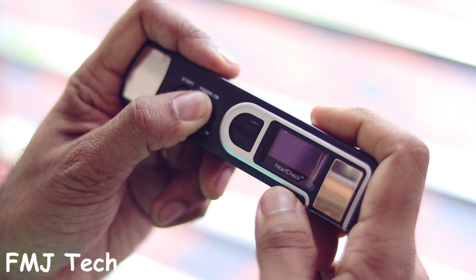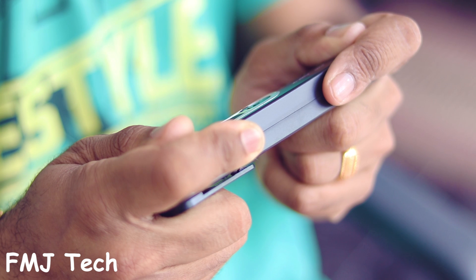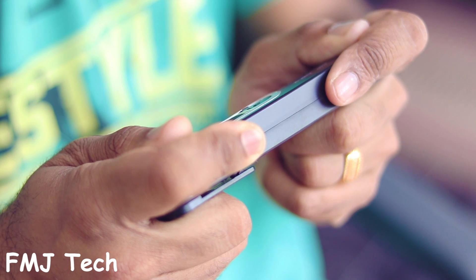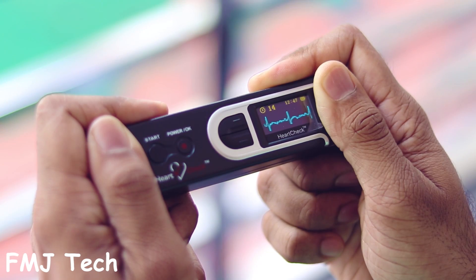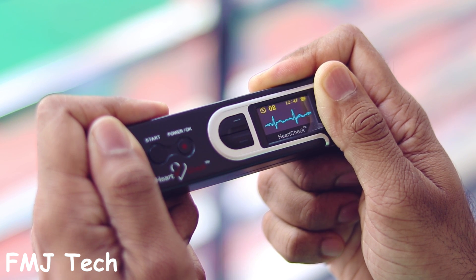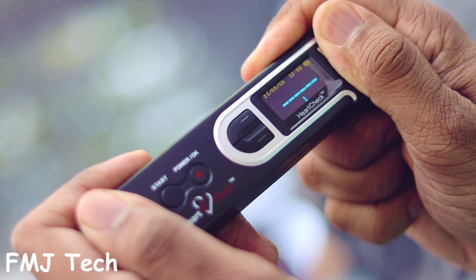Now let's take a look at how to take the ECG by ourselves. It's a very simple process. Start by pressing the power button and hold the device ensuring the metal electrodes are in contact with your skin. Your right and left index fingers should make full contact with the metal electrodes located on the top and side of the device, and your left and right thumbs should make full contact with the two metal electrodes located on the front of the device. When ready, press the start button and after six seconds the device will start the ECG reading. During this period try to remain still and do not flex or move your fingers or arms until the reading is complete.